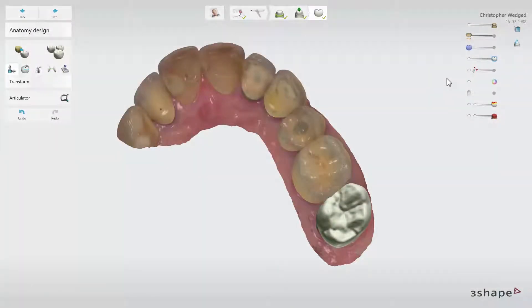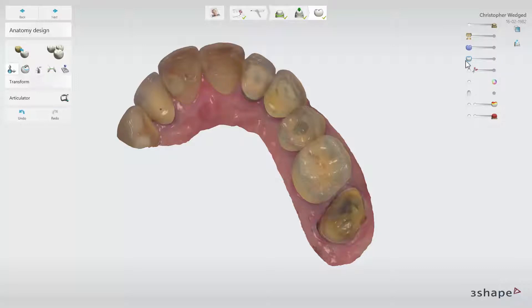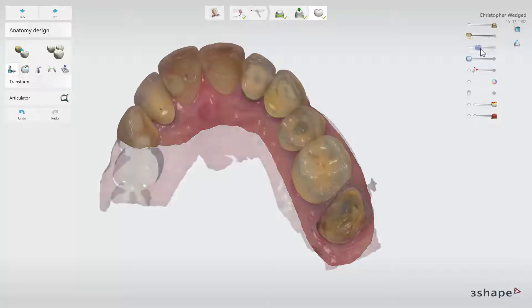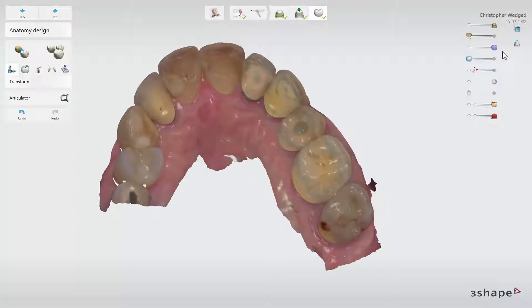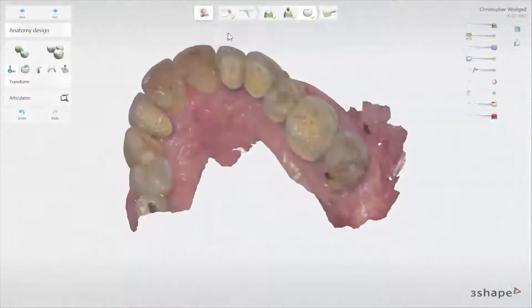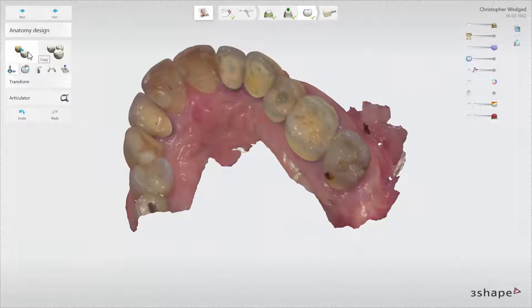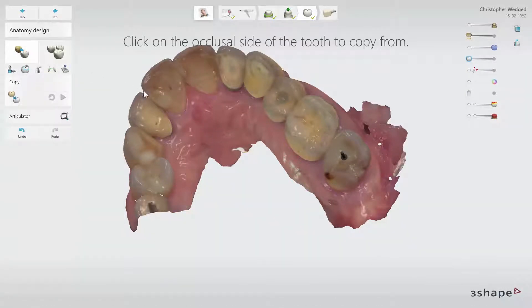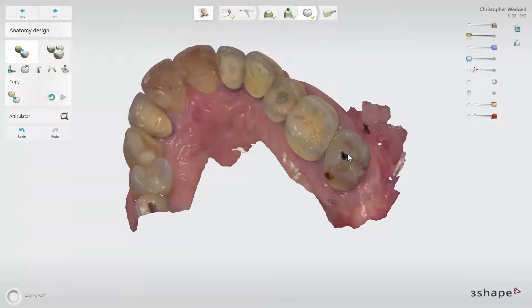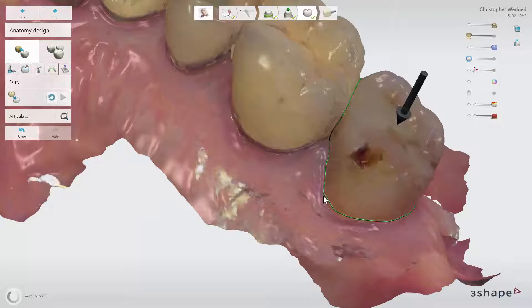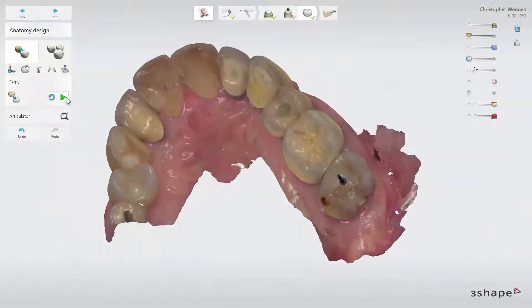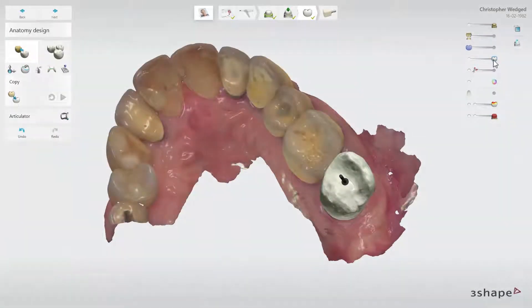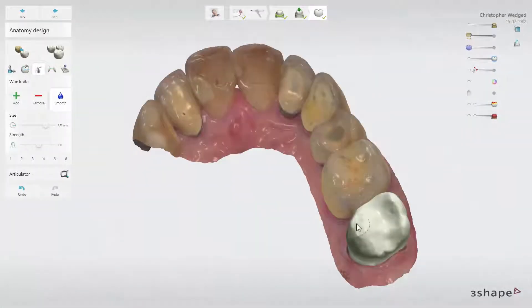In order to copy the tooth, slide the active item slider all the way to the left and slide the pre-preparation slider to the right. This should reveal the underlying pre-preparation tooth. You can now select the copy tool option and place the black arrow over the tooth as before. You may also have to adjust the area of the tooth that you wish to copy. When ready, click the green arrow to copy. Use the sliders to change the visibility and use the design tools to perform adjustments.